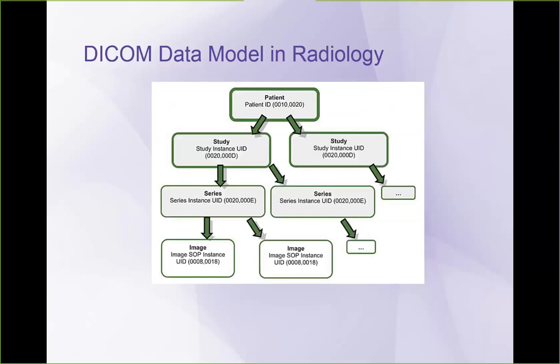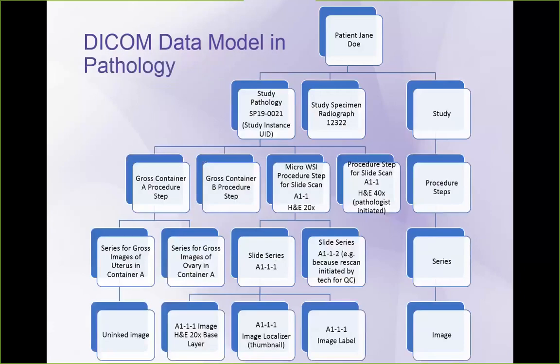So one of the things to consider is that we've worked closely with the HL7 specimen domain analysis model that Ricky also leads, very conveniently and helpfully for us. Her team has taken a look at the DICOM data model that exists in radiology, and we've mapped it to pathology, so we have a draft there. Next slide. It shows how we take the patient information, the study information, the series information, and individual images, and how it's organized in pathology versus what we know works very well in radiology. This is going to be published as part of the white paper, and we welcome feedback on it.